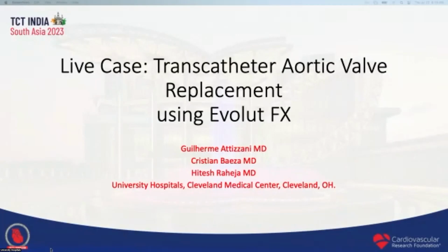So let's have Dr. Attizzani from University Hospital in Cleveland join us, please. He's going to show a live case of a self-expanding valve and cusp overlap view.